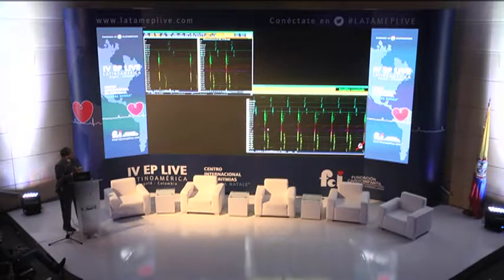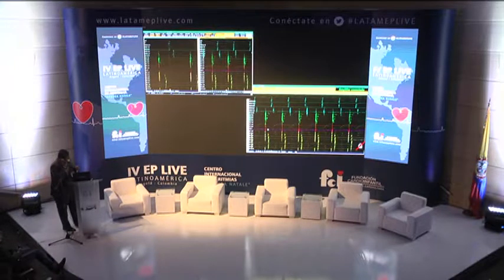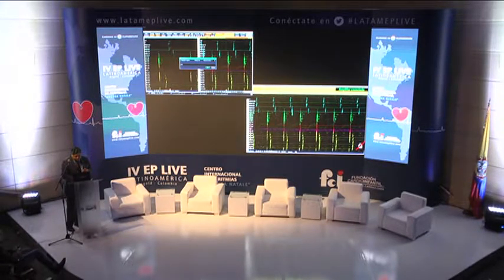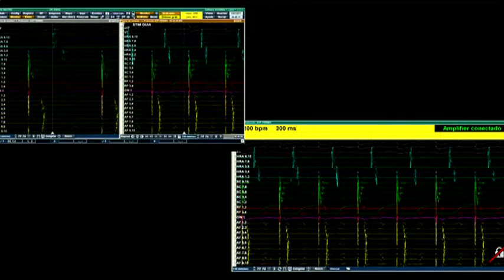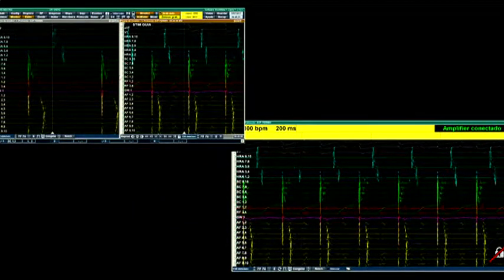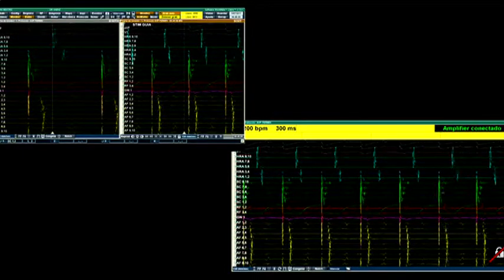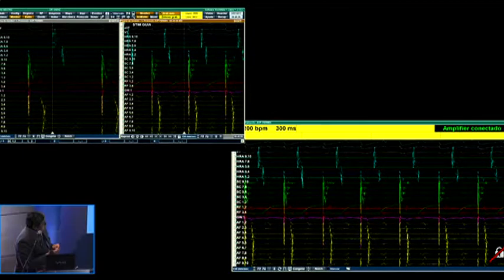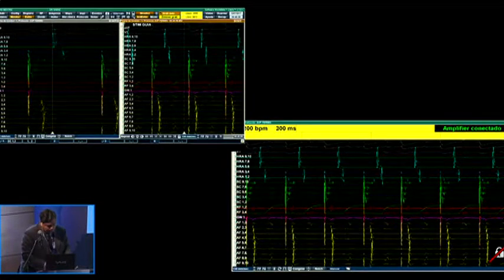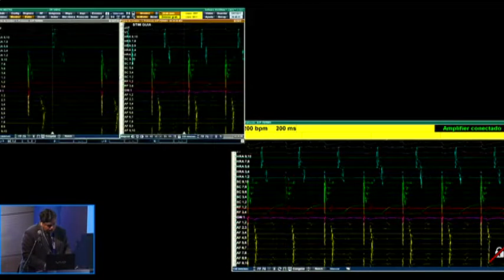Chief, this is very important. Yes, go ahead, say it in Spanish. Estamos estimulando del seno coronario distal. Pacing from the distal coronary sinus to the ablation catheter above, endocardically above the ablation line. And the electrogram of Marshall's vein is earlier than the endocardic. This suggests an epicardic connection in the isthmus.